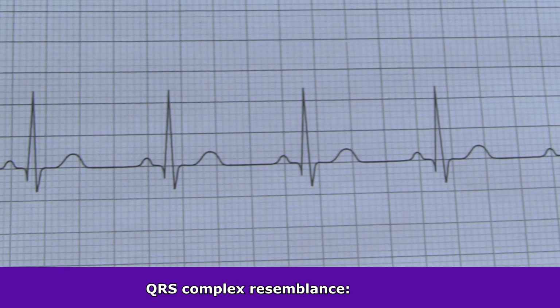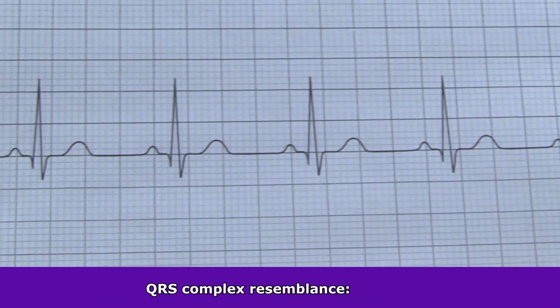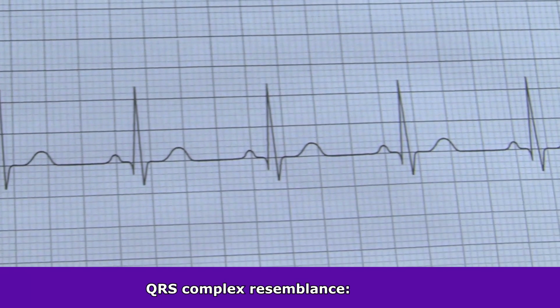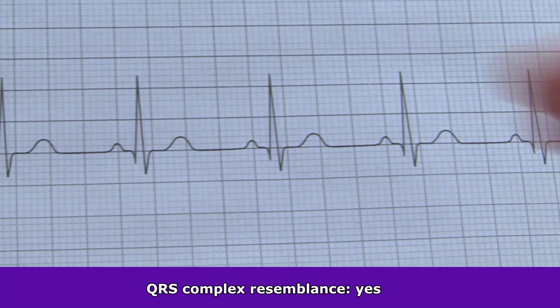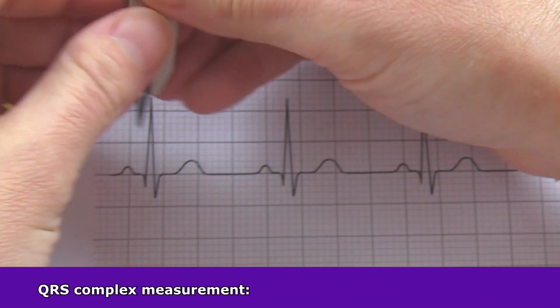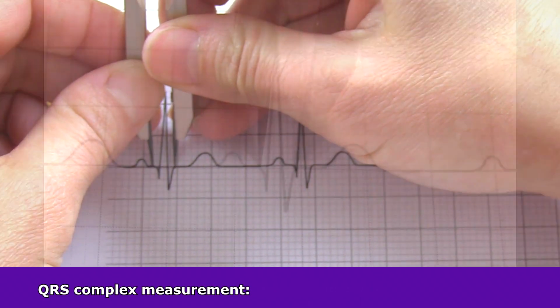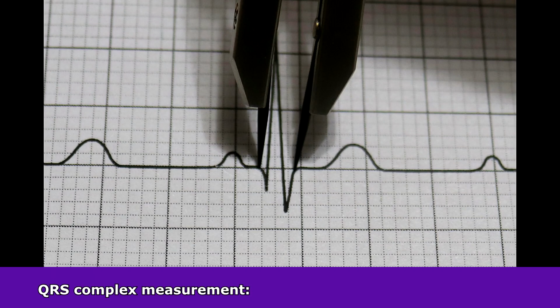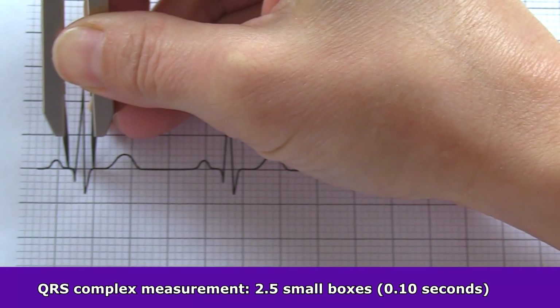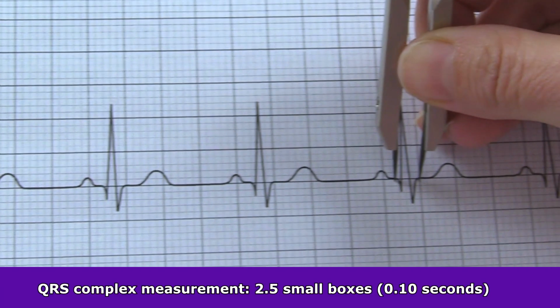And then lastly, the resemblance. Do these resemble QRS complexes? Are they where they're supposed to be? You're supposed to have one QRS complex after each P wave. They do, and they look like QRS complexes, and let's measure them. We're going to measure at the beginning of the QRS complex to the end right here with our calipers. When you measure it out and count the boxes, you get 2.5 boxes, which is about 0.10. And then just go down through the strip and measure to confirm.